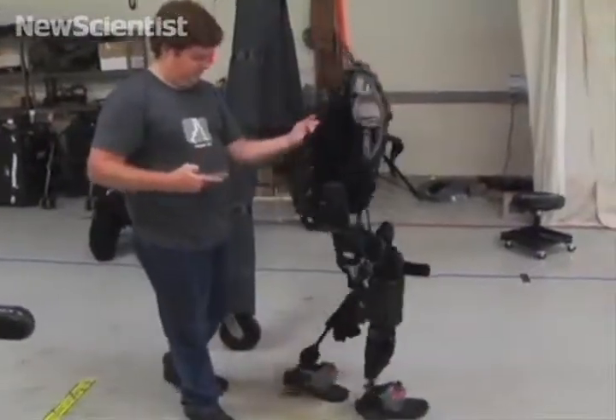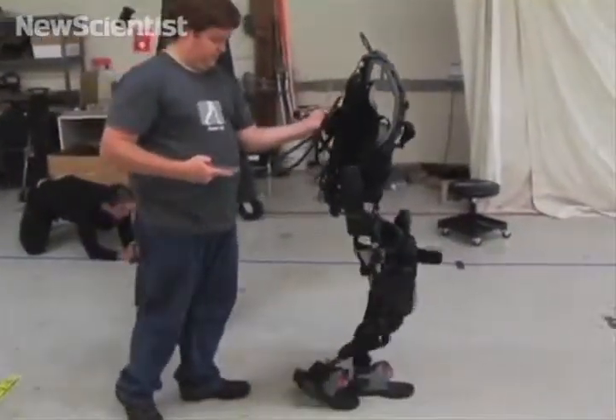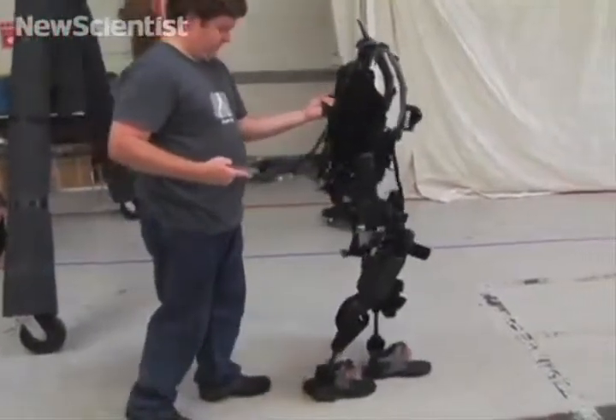The suit is a wearable robot with four motorized joints, an onboard computer, and batteries that allow it to work without a tether.